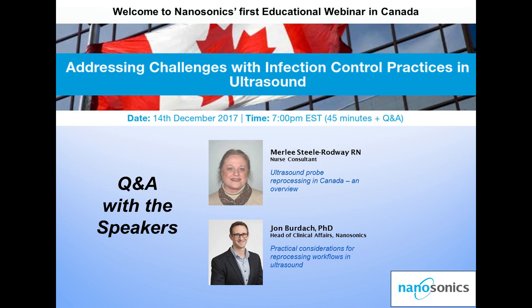So no, not all. There are not a lot of automated reprocessing methods out there. In our new standards, we do recommend that you utilize validated processes, but automated reprocessing methods will ensure your department is using the same method all the time. And I refer to the human factor: when something is being performed manually, we all come to work today, and nobody means to forget a step or to make an error.